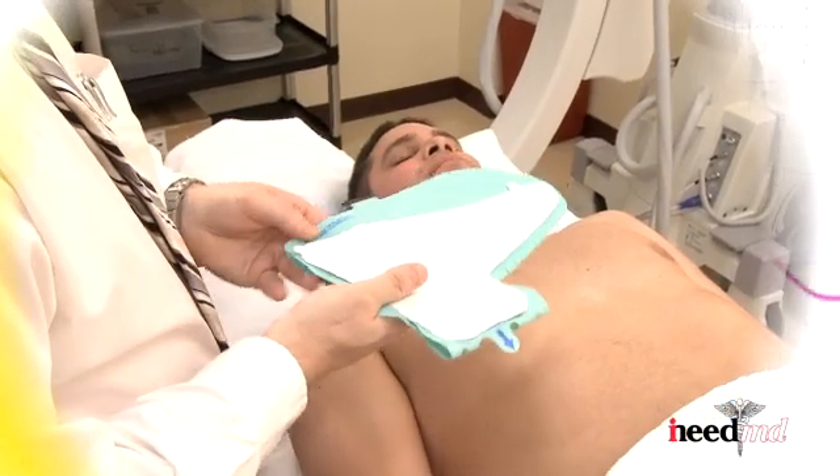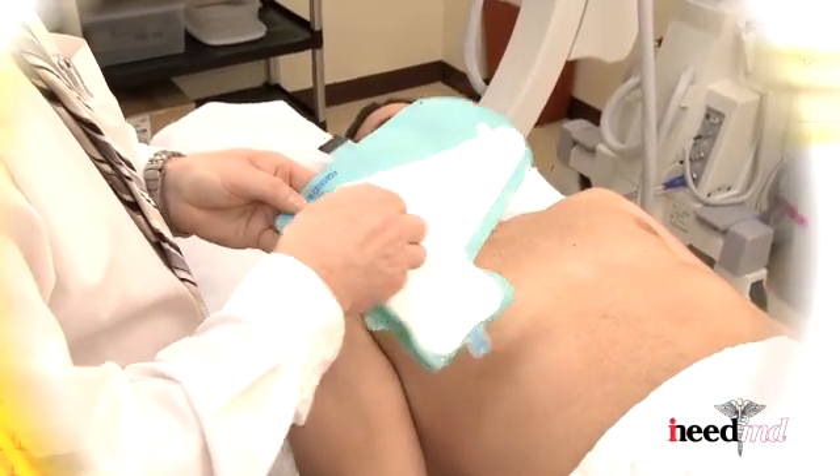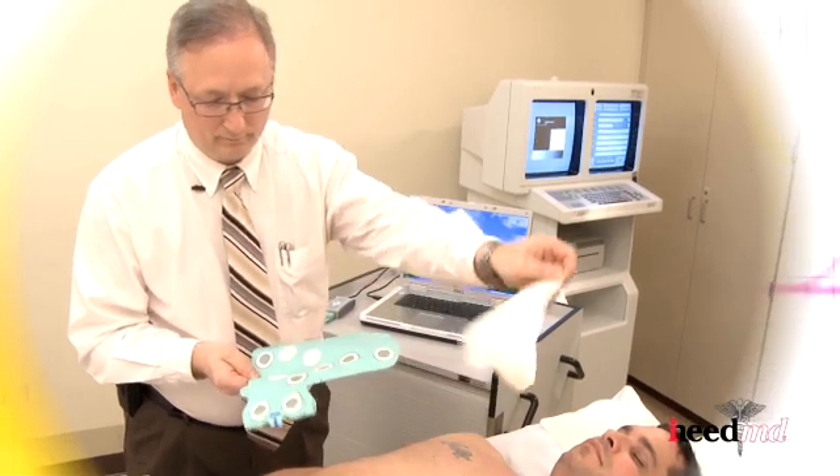The first step is to pull and remove the white release liner that covers the electrodes from the palm side of the glove.